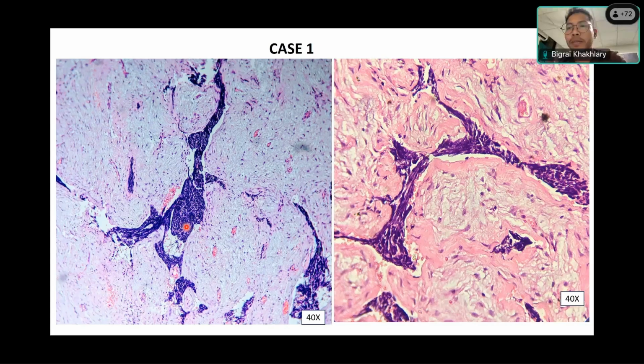No, ma'am. Okay, now look at the cells. What is the color of these cells? Blue, dark blue. Yes, so they are blue cells. Aren't these areas blue in color? Yes, ma'am. Okay, age is a child. These are all blue colored, nests of cells, cords of cells, and they are surrounded by a lot of stromal tissue, which at places feels fibrillary, so you feel it is neural, and there are congested vessels.